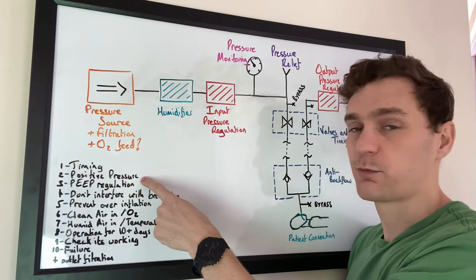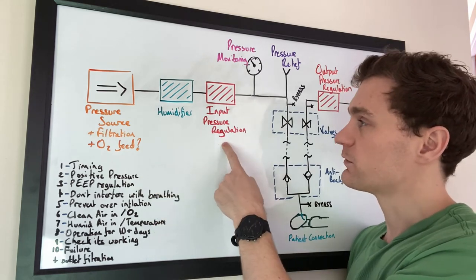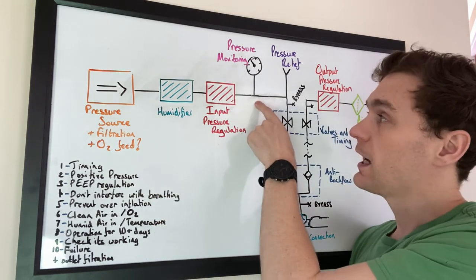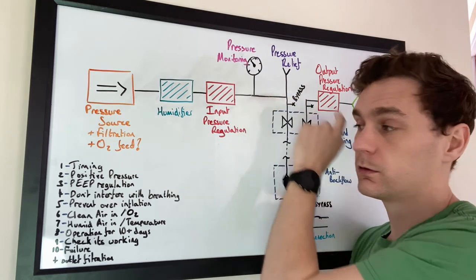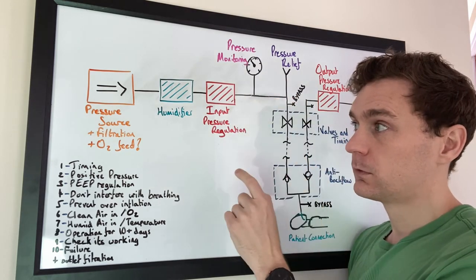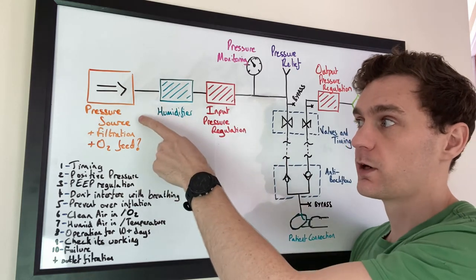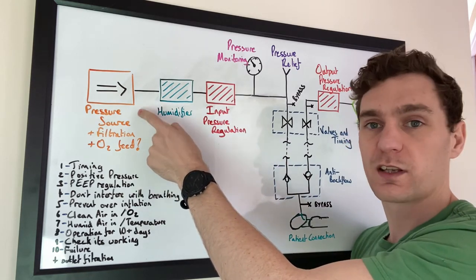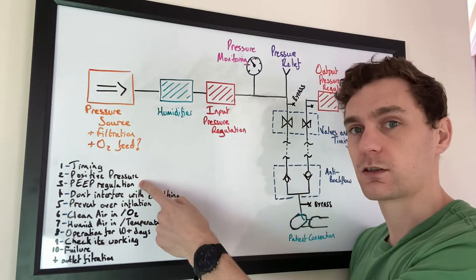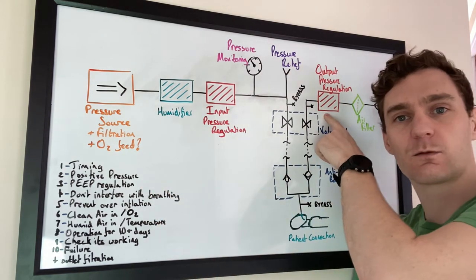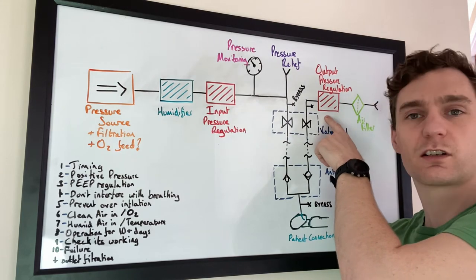Second thing, positive pressure. Yep, we've got input pressure regulation here and we've got pressure monitoring. We also have this pressure relief and that's all being delivered by the pressure being maintained by this pressure source. Third thing, PEEP regulation. Yep, that is exactly what this is doing. This is the PEEP pressure regulator.